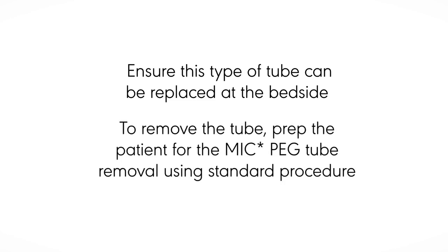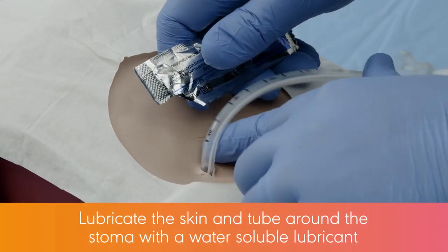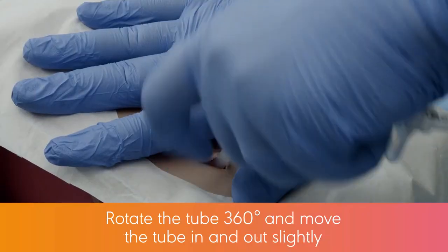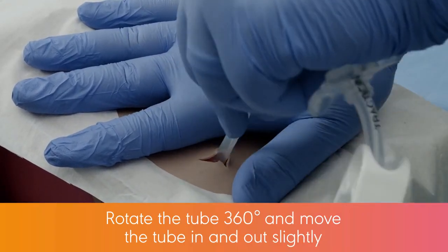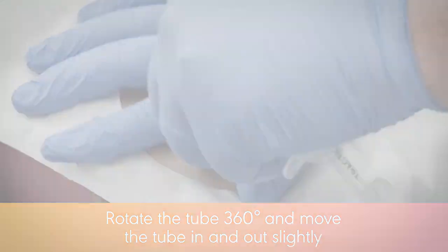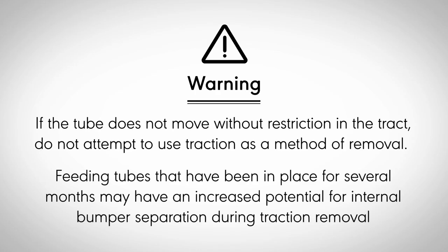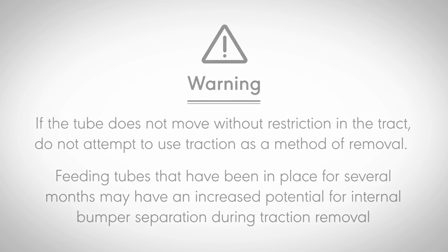To remove the tube, prep the patient for the MIC-PEG tube removal using standard procedure. Lubricate the skin and tube around the stoma with a water-soluble lubricant. Rotate the tube 360 degrees and move the tube in and out slightly. Warning: if the tube does not move without restriction in the tract, do not attempt to use traction as a method of removal. Feeding tubes that have been in place for several months may have an increased potential for internal bumper separation during traction removal.